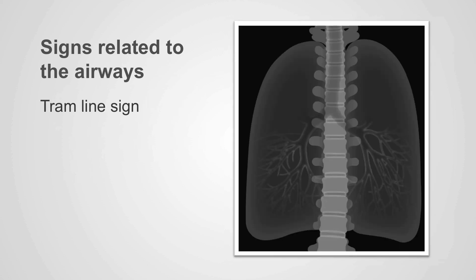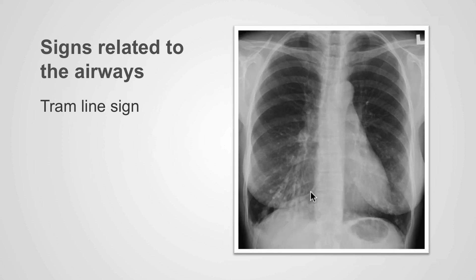Occasionally, the bronchi can be dilated and thickened. These bronchi can then be seen as parallel linear shadows on an x-ray, similar to train tracks. When present, these are called the tram track sign and are associated with cylindrical bronchiectasis. In this example, within the right lower lobe, we can identify parallel linear lines representing the dilated and thickened bronchi related to bronchiectasis.